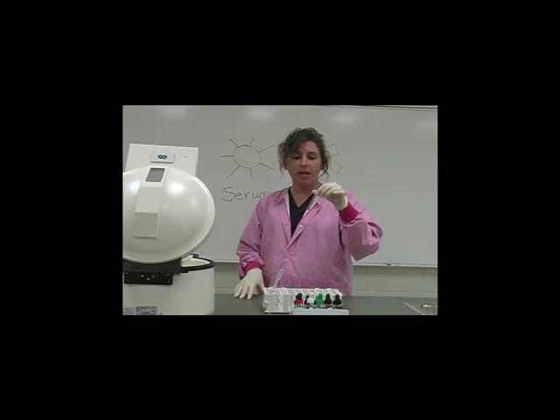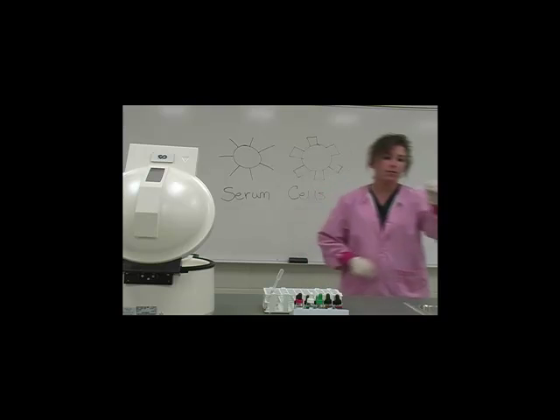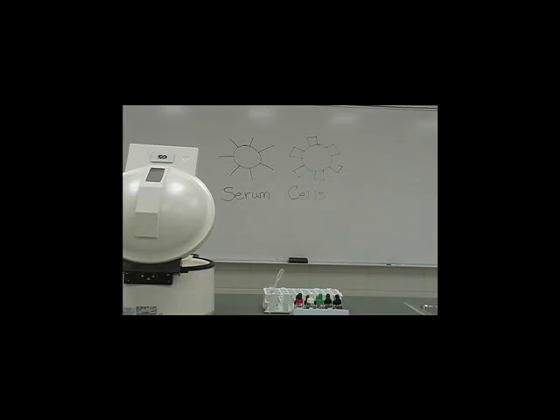Again, we'll do the same thing for our B. In this tube, I'll step around a little closer. You will notice that I have no clot in the tube. It's just a clear rolling drop of blood.